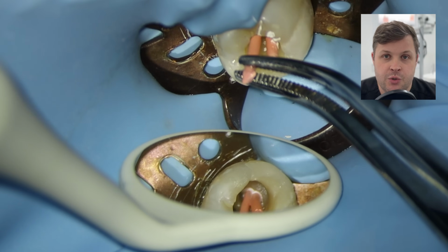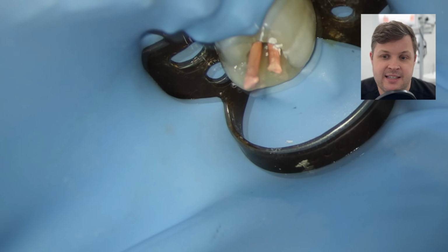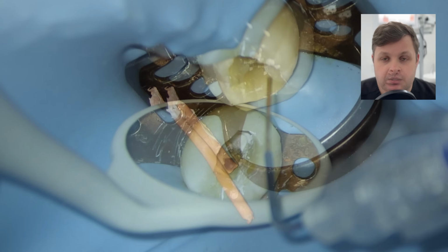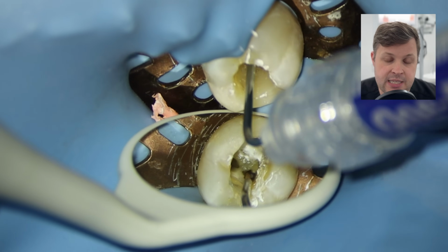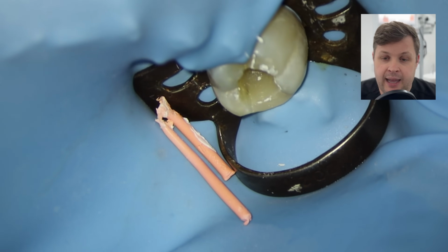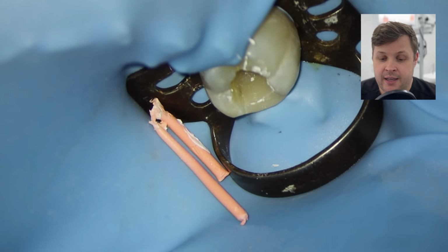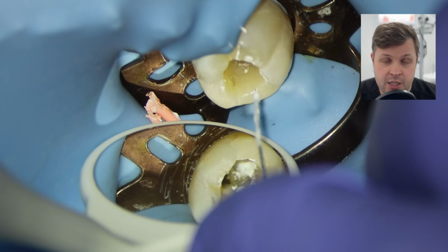And then again, I'm just going to use a heated plugger here just to remove the excess, and I'm going to use a Mach 2 plugger just to push this down. And again, the protocol is the same for the two other canals. Of course, we know that the mesiobuccal canal is our main canal, shall we say. So I'm going to obturate that one first. Again, I'm going to place the sealer with our visco tip, and then I'm going to push a size 10K file to length, and then I'm going to push the GP nice and slowly to length.